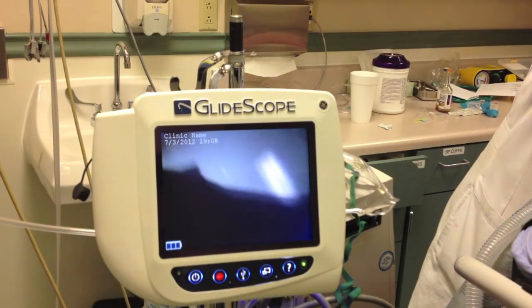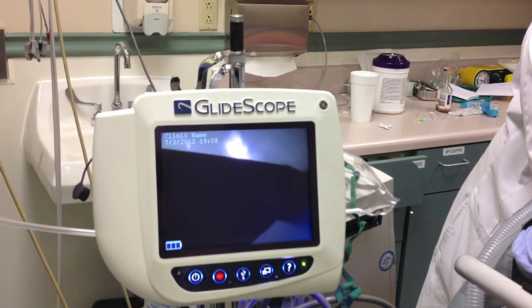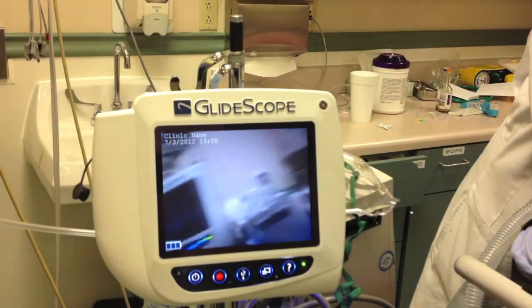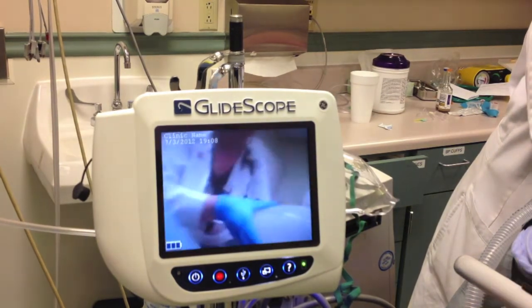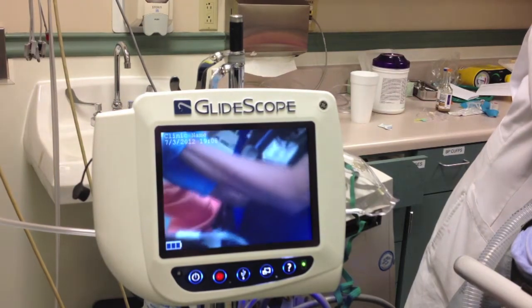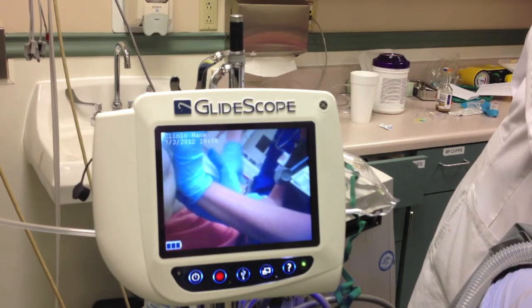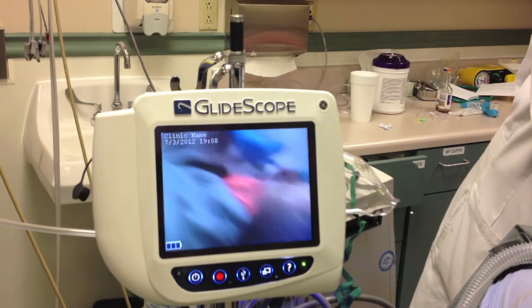We had time to prepare and use this instrument, and this is my first time using this specific glidoscope. The previous one I used was very similar to the regular blade — it just had a camera attached. This one is a little different: it was more curved and shorter, so you're going to see that I had a little difficulty just getting the tube in. The patient is being pre-oxygenated right now with a bag-valve mask to make sure the patient has the most oxygen reserves.